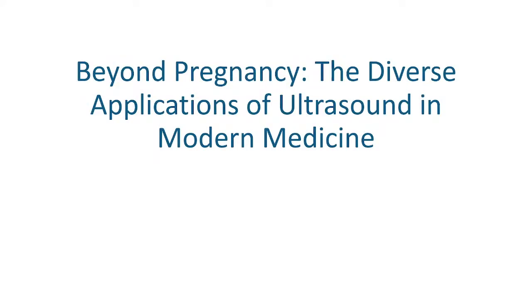Hello, everyone. Most of my male clients or patients think or feel that ultrasound is only meant for pregnant scanning. So they get the surprise of their lifetime when they are referred for an ultrasound scan. So now, let me introduce to you medical ultrasound, even to those who are already practicing, the applications of medical ultrasound.